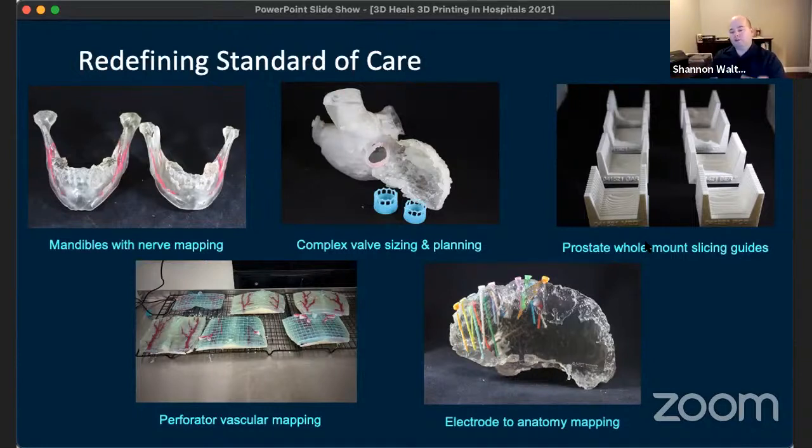They don't really use this to drive any decisions before treatment, but it's a follow-up to say, was the radiologist report close to being reality? And then they're using that as a feedback loop to continually get better at the radiology part of identifying whether any of the lesions in the prostates are actually cancerous and how to grade them properly. And we've done, I think, 500 of those by this point, if not more.